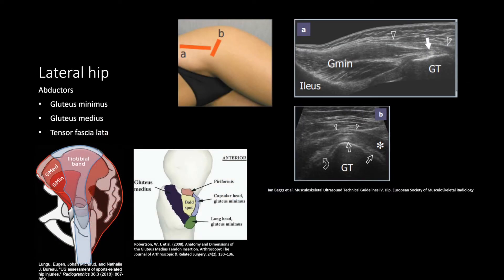For the lateral hip, lay the patient on their side. Use the tensor fascia latae as a landmark and move the probe down to the greater trochanter. The gluteus minimus tendon is at the anterior facet of the greater trochanter. The gluteus medius is at the lateral facet, and just superficial to the posterior facet is the greater trochanteric bursa, which is usually not filled with fluid in normal conditions.